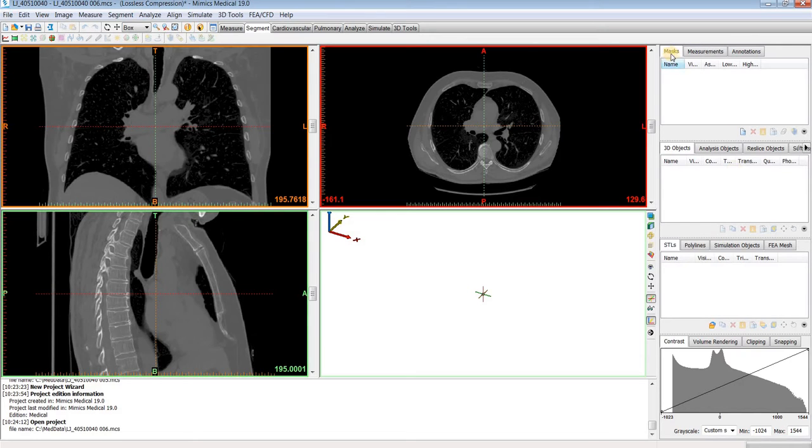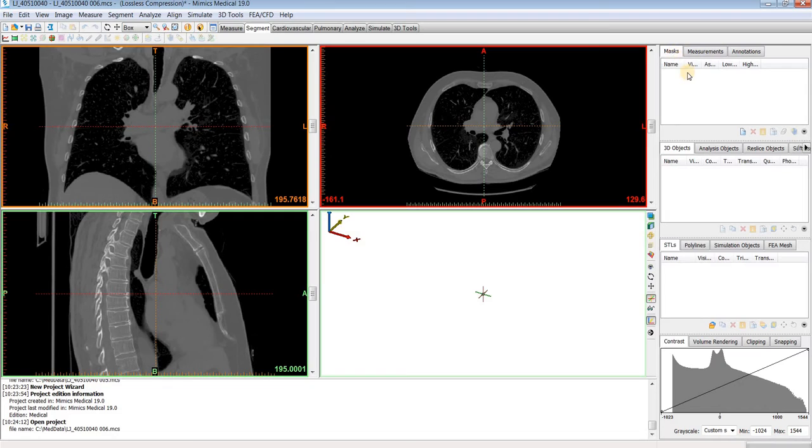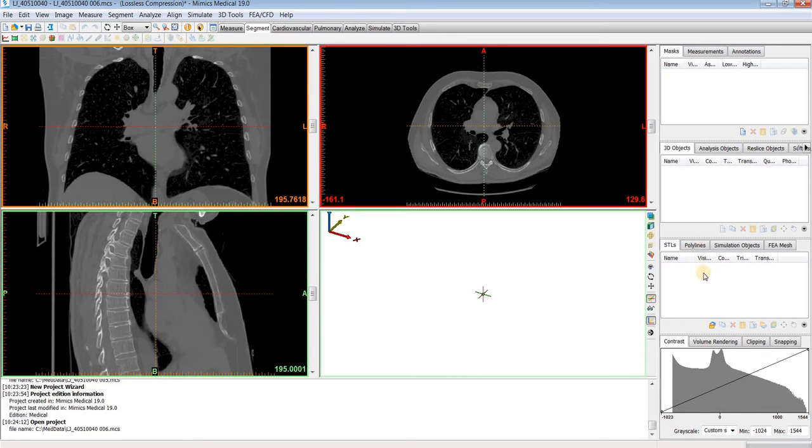On the right hand side of the software is our project manager. We have different tabs for our masks, which are our segmentations, 3D objects are below that, which are 3D models, below that is the tab for any STLs that you import, and then in the bottom right is our contrast tab.